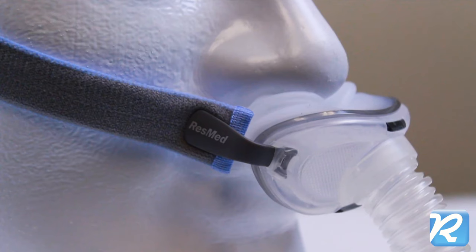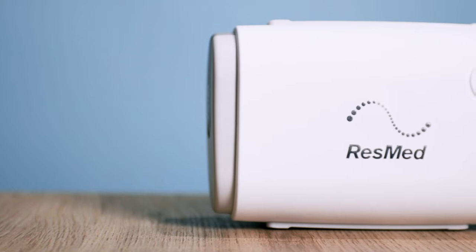It's very compact and it's lightweight, and I like the ingenuity of thought behind features like the heat moisture exchange system. But whether you enjoy sleeping with this added weight close to your airway depends on the user. Most people don't mind, but I have heard of others who find this unit unusable because of it.